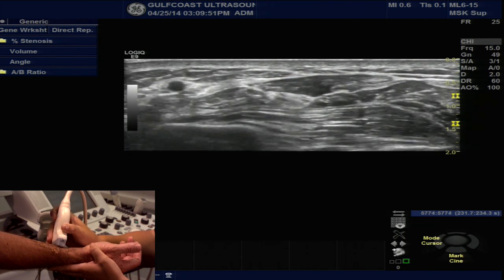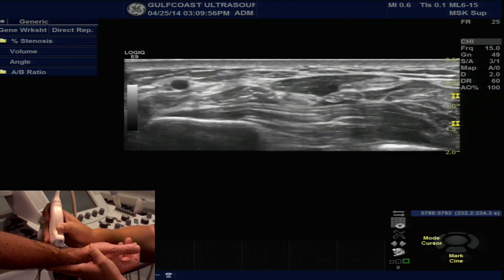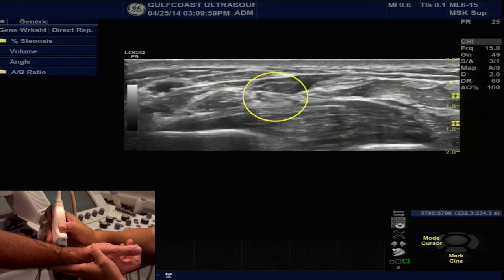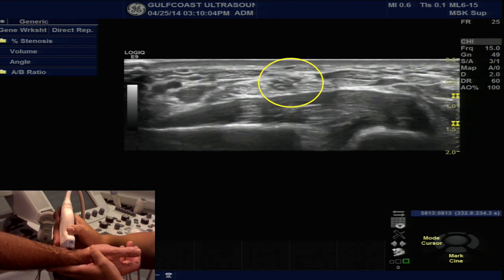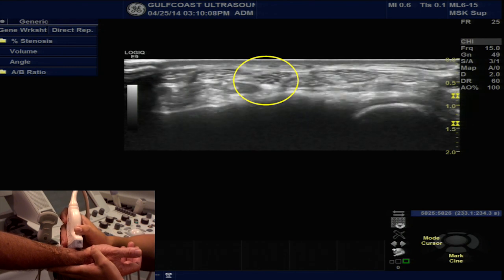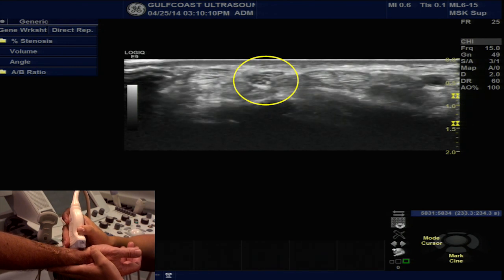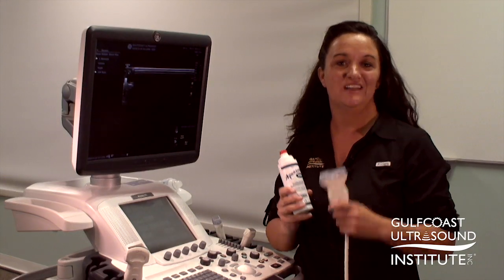The surrounding tendon and muscle almost becomes completely anechoic as I adjust my angle. So slowly now, let's watch that median nerve as it goes into the carpal tunnel and pops in right there, as you can see it just underneath the surface of the skin. Now, it's your turn.